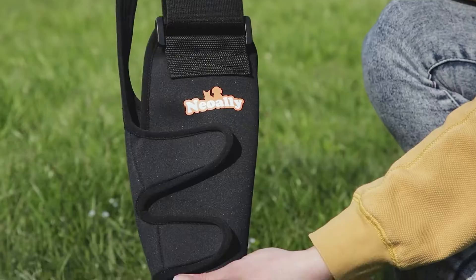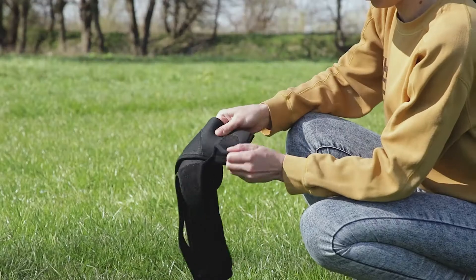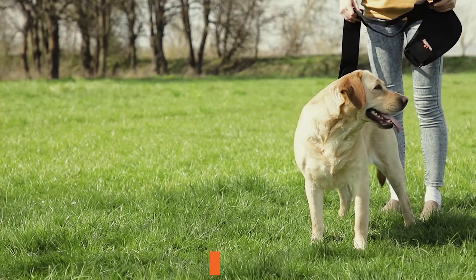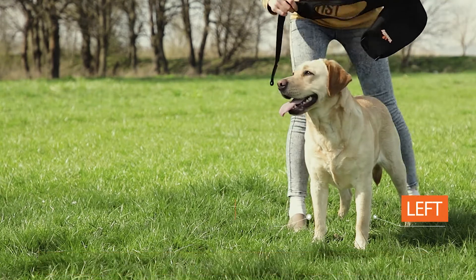The NeoAlly Dog Elbow Brace is specifically designed to fit either front leg, left or right. Stand behind your dog to see which leg needs elbow support, left or right.